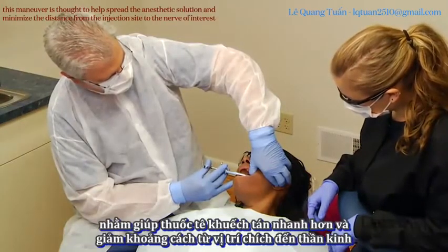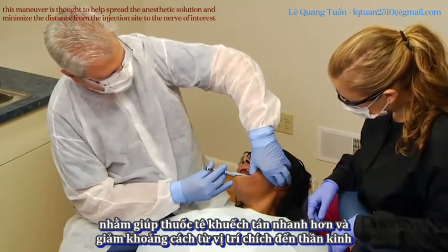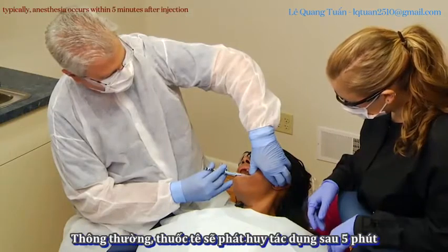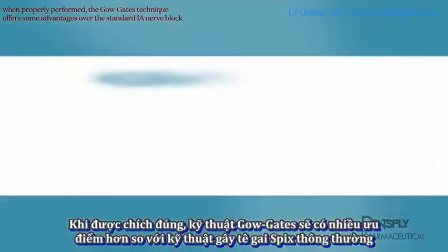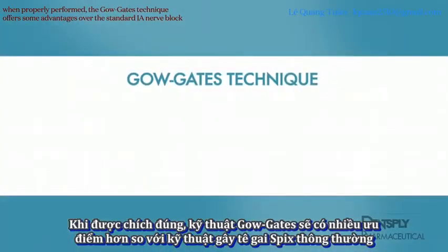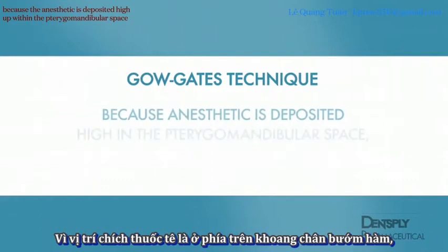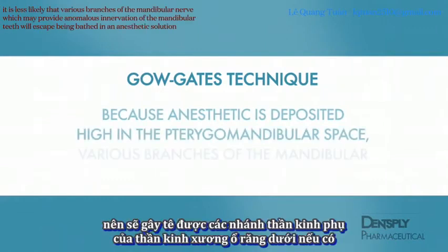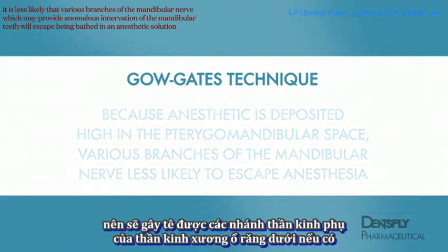This maneuver is thought to help spread the anesthetic solution and minimize the distance from the injection site to the nerves of interest. Typically, anesthesia occurs within 5 minutes after injection. When properly performed, the Gow-Gates block offers some advantages over the standard inferior alveolar nerve block. Because the anesthetic is deposited high up within the pterygomandibular space, it is less likely that various branches of the mandibular nerve, which may provide anomalous innervation of the mandibular teeth, will escape being bathed in anesthetic solution.